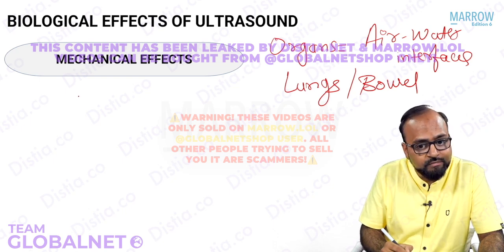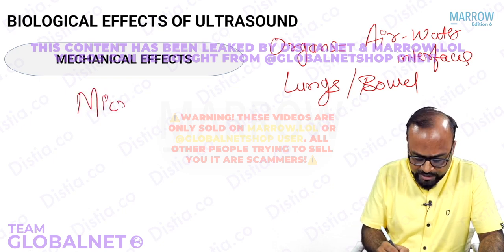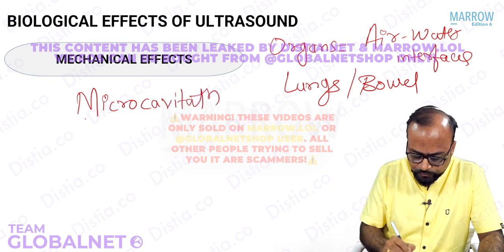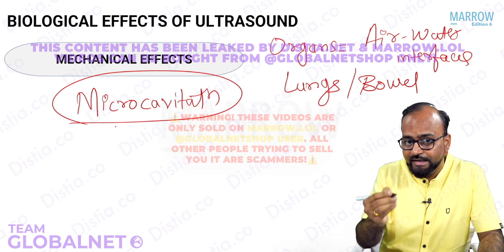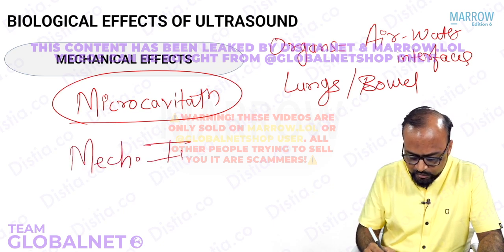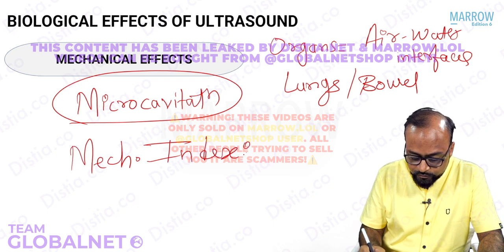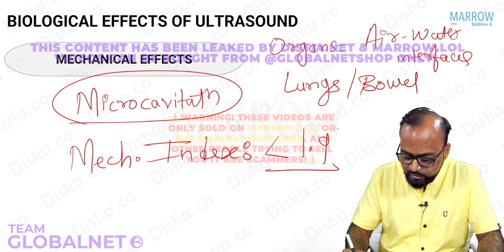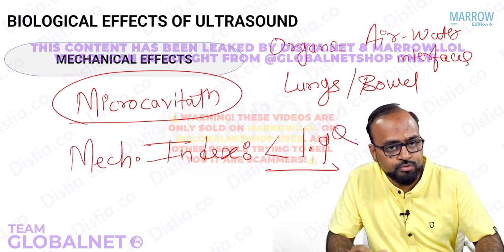This is basically given a name. This is called microcavitation. Remember this word. So there is an index which is defined, that is called the mechanical index. The value of the mechanical index should always be less than 1.9. That is the upper limit which is used.